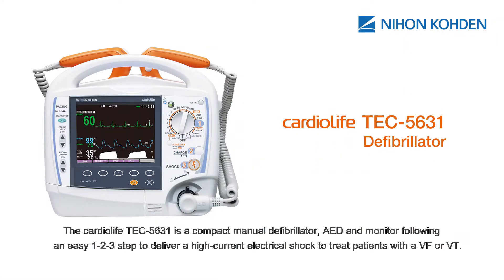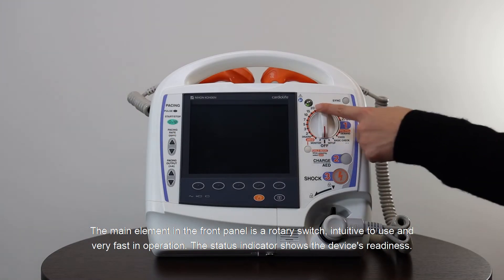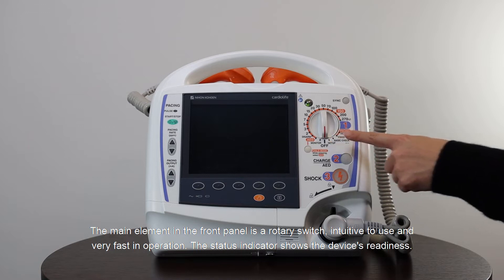The Cardiolife TEC5631 is a compact manual defibrillator, AED and monitor, following an easy one, two, three step to deliver a high current electrical shock to treat patients with VF or VT. The main element in the front panel is a rotary switch, intuitive to use and very fast in operation.